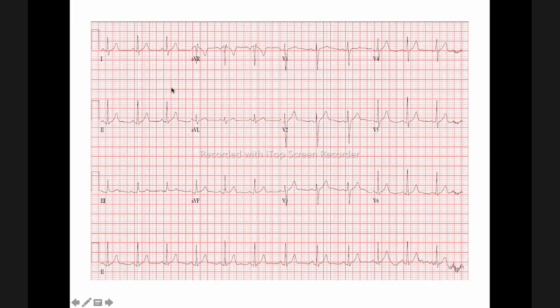I will not talk about tachycardias. So this is a normal ECG, okay? The strip that we like looking at and we encourage students to really know very well is lead 2, because lead 2 shows a lot of things. This is a long lead too. You see, it's from the beginning there to the end there. So this lead 2 will show you a nice P wave, will show you a Q, R, S, then a T wave. Then again, it starts P, Q, R, S, T. As you can see from this, it's coming in a very regular fashion, is it not? If we had the paper to measure here the distance between these QRSs, it's equal, okay? So it's regular.